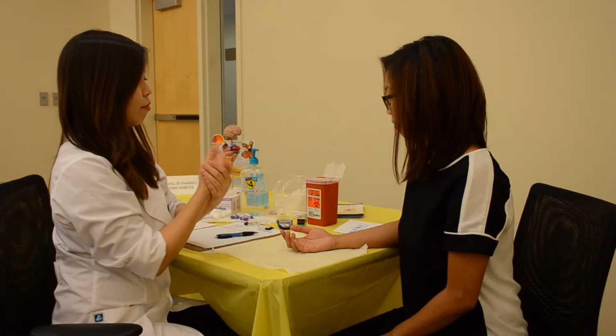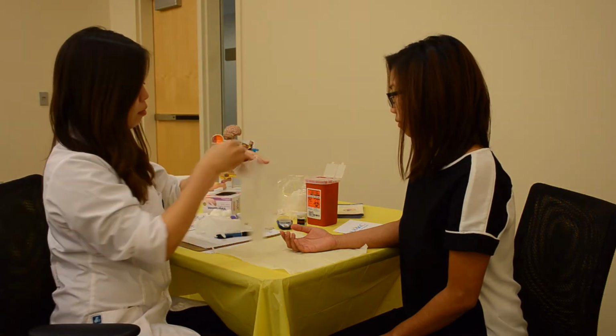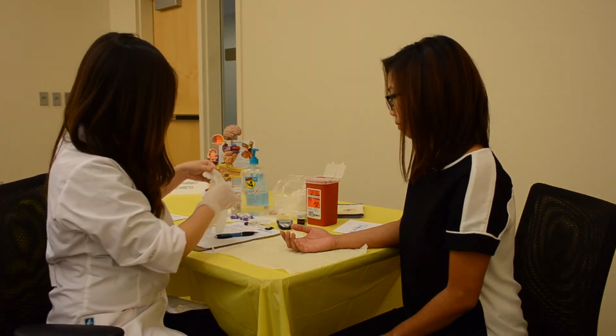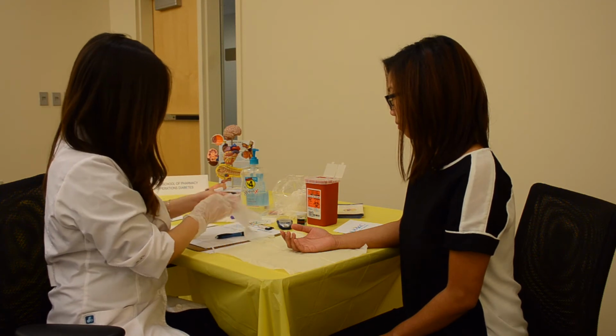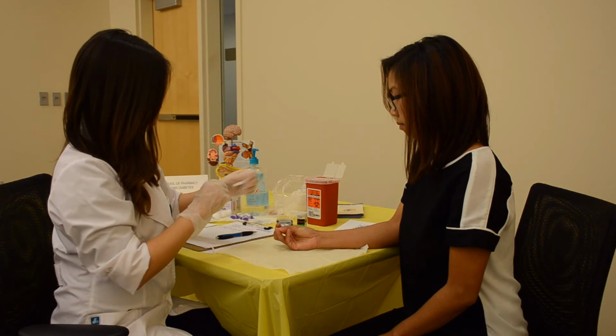Disinfect your hands with hand sanitizer. Put on a pair of gloves. You will use a new pair of gloves for each patient. Use an alcohol swab on the fingertip of their choice to clean the area and increase the circulation for blood flow.